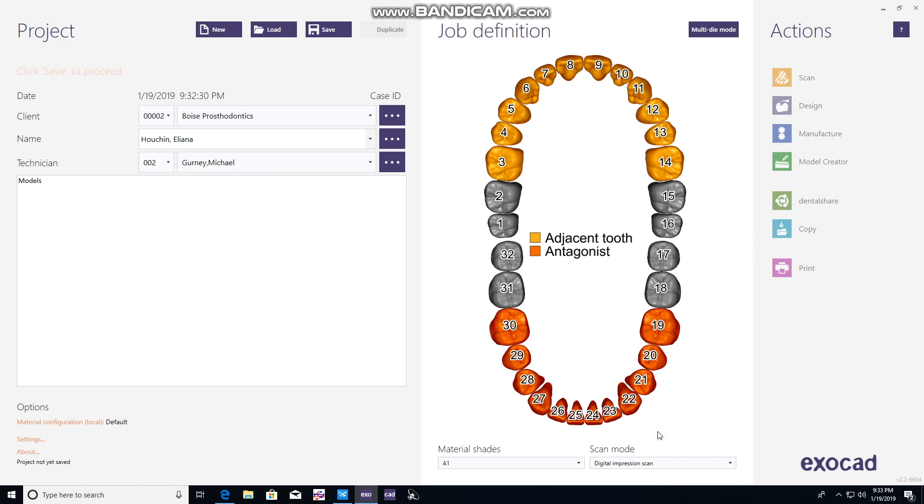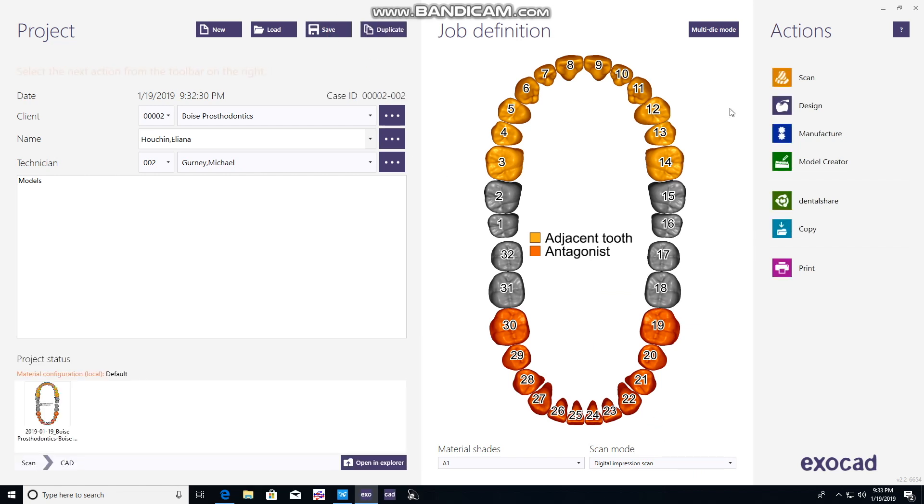Click on material or scan mode, select digital impression scan, hit save, and then we're on to creating a model.